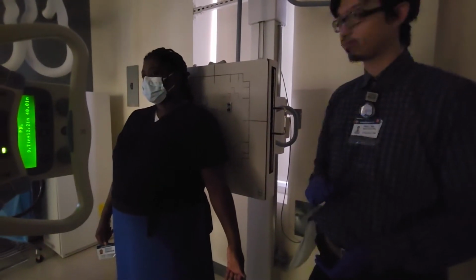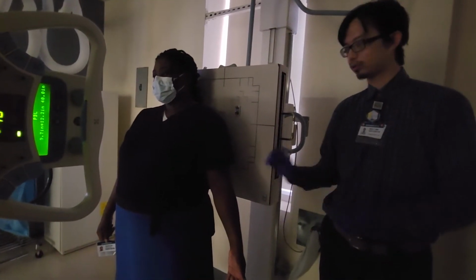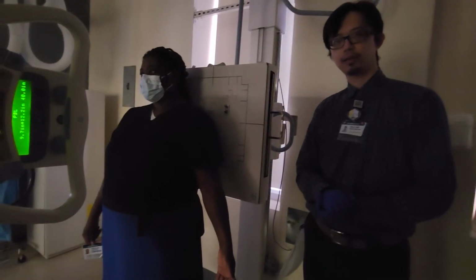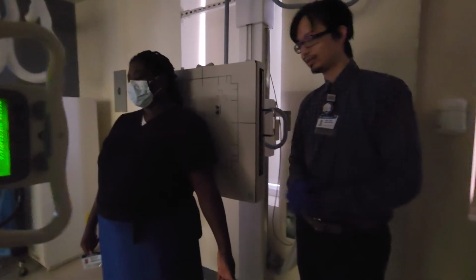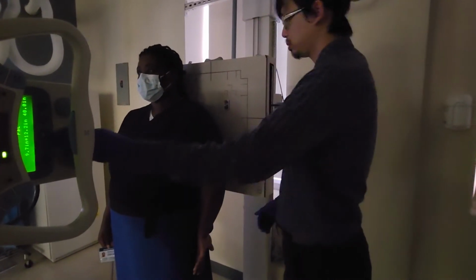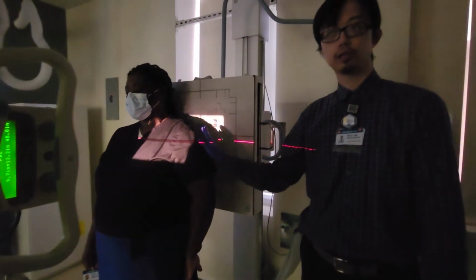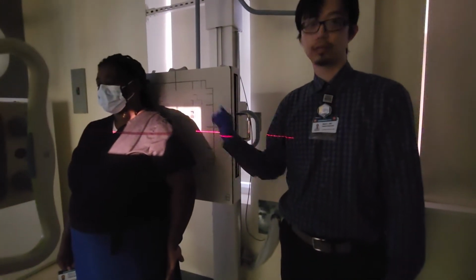Okay, internal rotation. You position this the same way as your lateral humerus. So what do we do with this arm? Epicondyles perpendicular to the IR. And how do we do that? Like a mini chicken wing. Chicken wing, that's right. So we're going to ask our patient to turn their arm in. Slight bend, back of the hand against the hips. Okay, check our epicondyles, make sure they're perpendicular. And this is our internal rotation shoulder, right? Still an AP shoulder, just internal rotation.